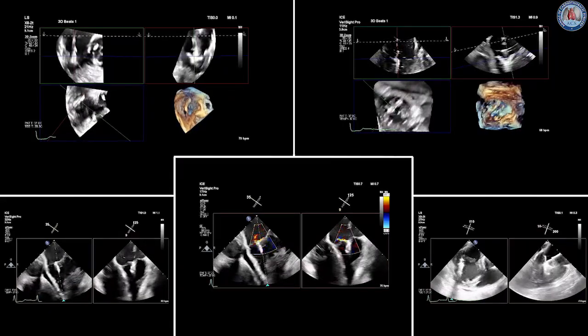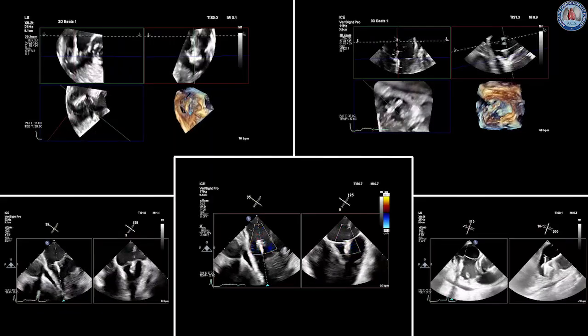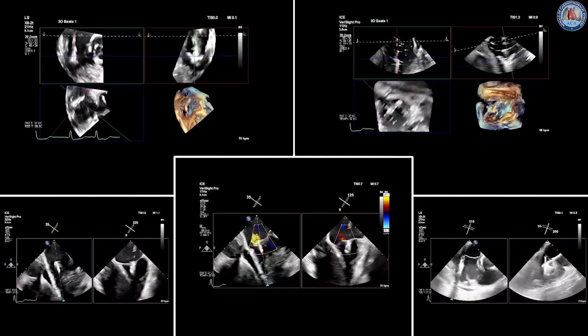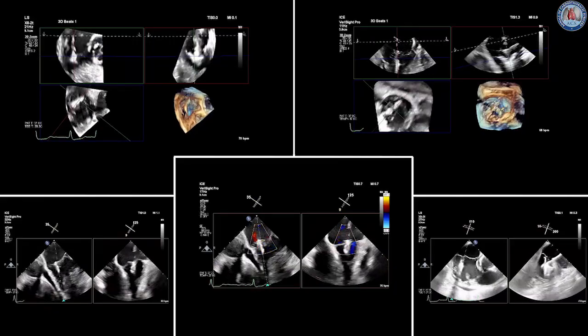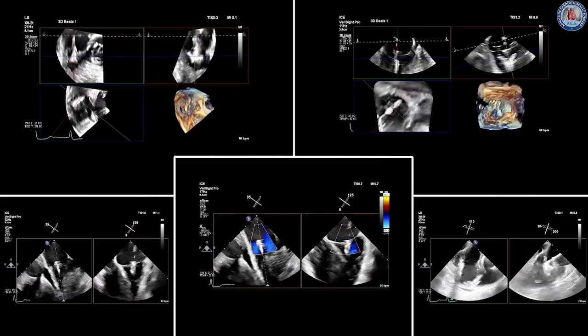Color Doppler demonstrated an improvement in TR. However, residual regurgitation persisted. TEE imaging was subsequently used to confirm appropriate leaflet grasp and ensure the absence of side biting. As demonstrated in the bottom right image, the septal leaflet was visualized as inserted, but not fully captured or optimally seated.